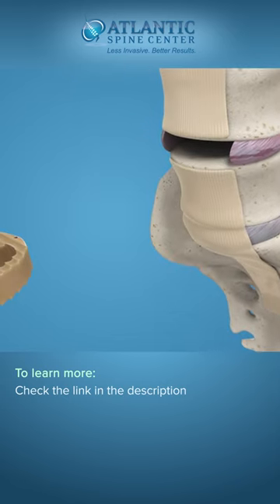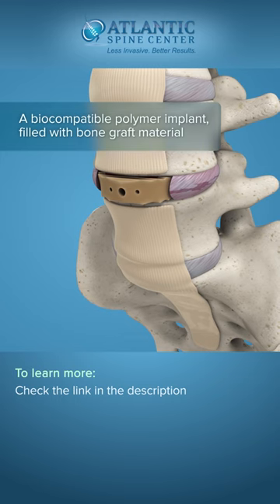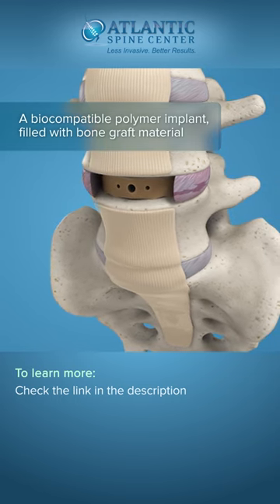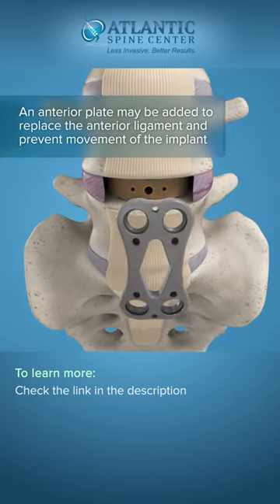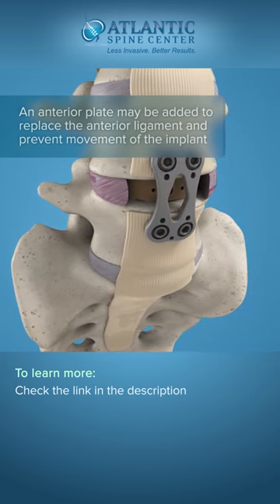After the disc is prepared, a biocompatible polymer implant is filled with bone graft material and placed in the disc space. With an ALIF implant, the surgeon may choose to add an anterior plate to replace the anterior ligament and prevent movement of the implant.